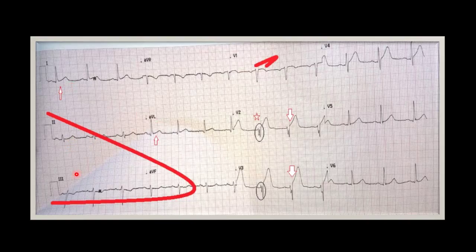Let's look at leads 2, 3, and AVF. Can you notice that there is subtle ST segment depression? More prominently in lead 3 and AVF than in lead 2, and this is most likely reciprocal changes coming from the anteroseptal leads, which we're going to have a look at now.